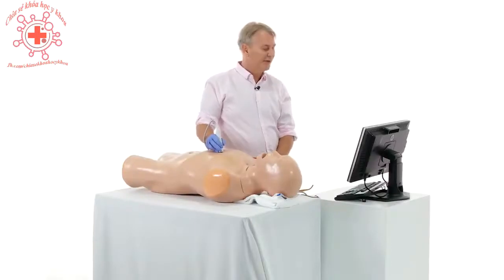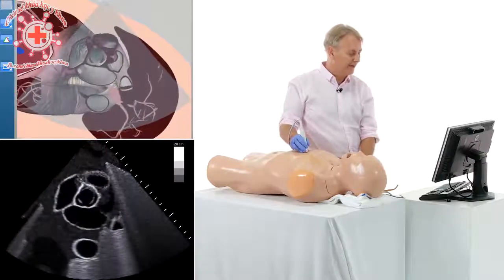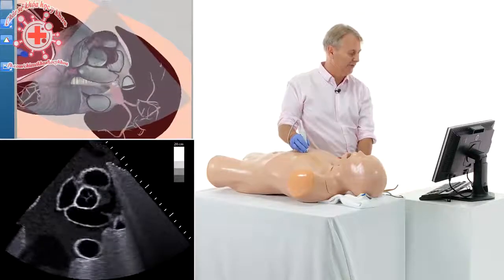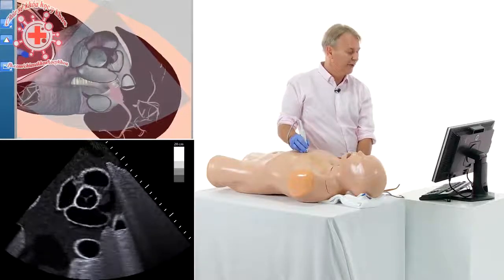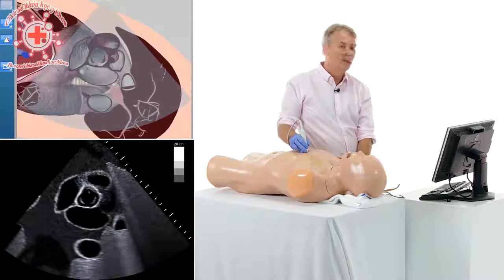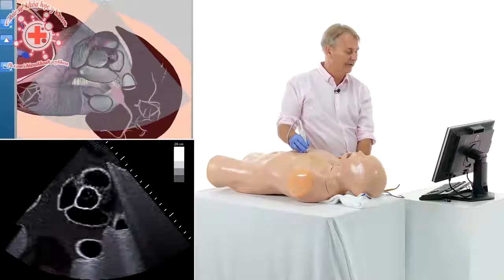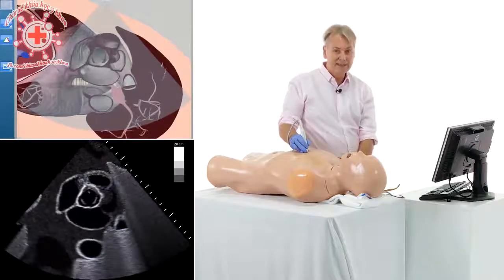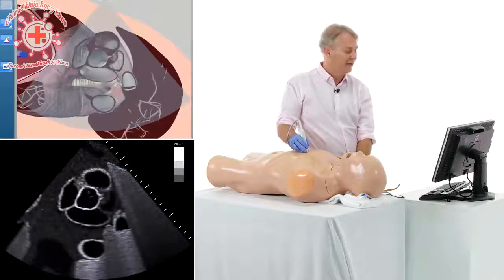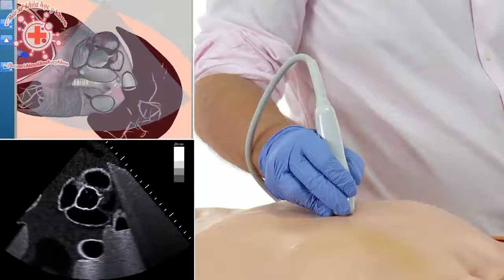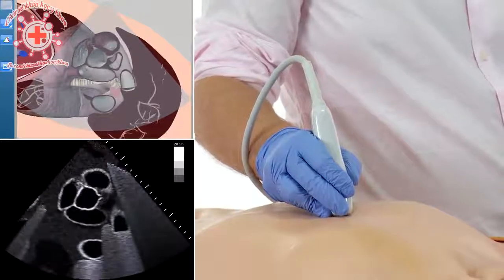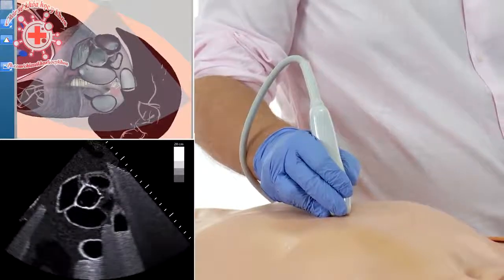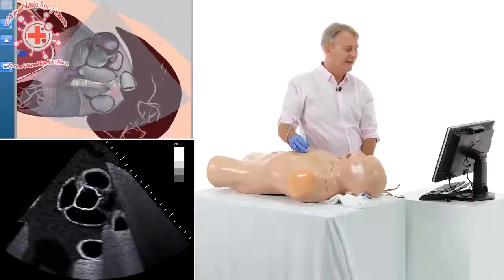Let's look at the short axis view on the simulator and see how we can identify the different cusps of the aortic valve. This cusp, which is close to the interatrial septum, is the acoronary cusp. The cusp close to the pulmonary artery is the left coronary cusp, and the one close to the right ventricular outflow tract is the right coronary cusp. Once you identify the cusps, it's also easy to tell which coronary arteries leave the aortic root — here would be the right coronary artery and here is the left coronary artery.